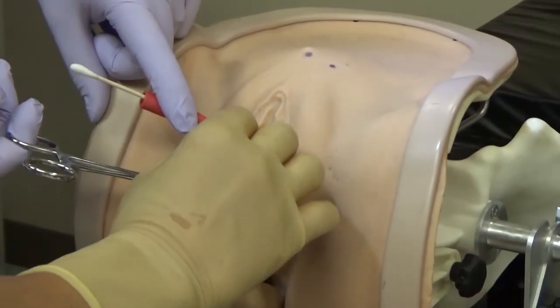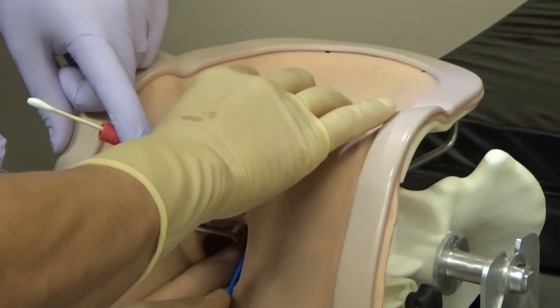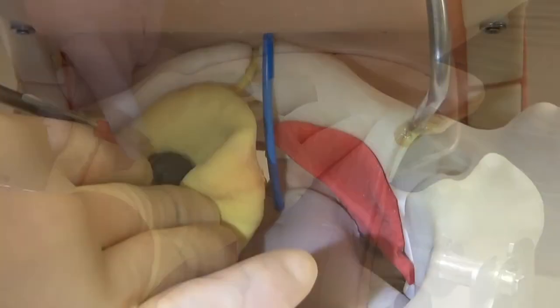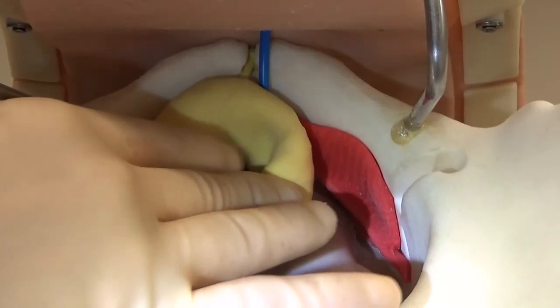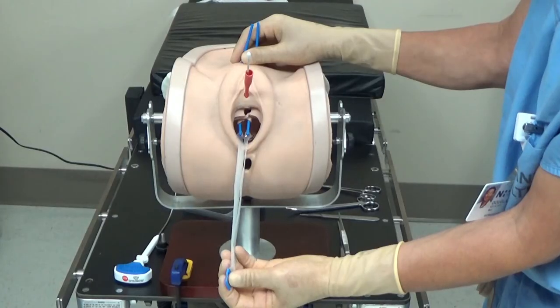Once the suprapubic skin is tented, the hand on the trocar handle is used to give countertraction to facilitate passage of the needle tip through the skin. This is the retropubic view with the bladder in place. The steps are repeated for placement on the contralateral side, and cystoscopy should be performed, confirming no urethral or bladder injuries. And of course, this is what we all should see on your cysto.